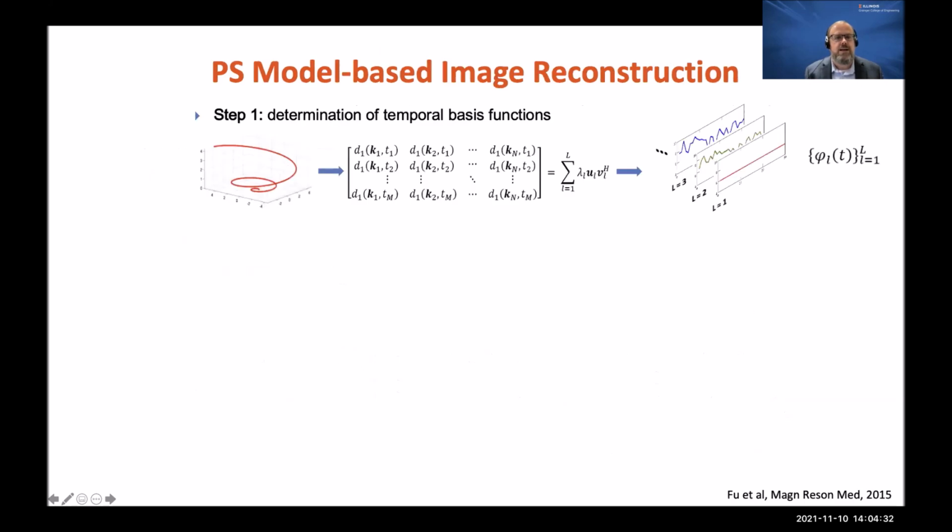And then at the end, I take all my cones, and I think I flipped the order here. So this is the K-space direction for the first time point. This is K-space for the second time point of just this cone data. I arrange it like this, and I do a singular value decomposition, and I'm going to take the L, just 10 or 20 right singular vectors from this, and these are going to give me my temporal waveforms that I've detected in the data.